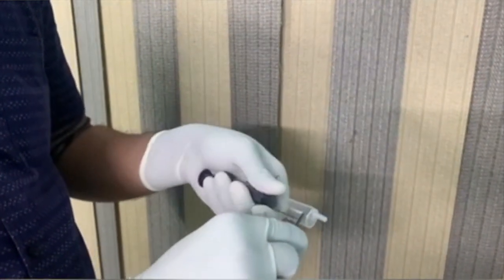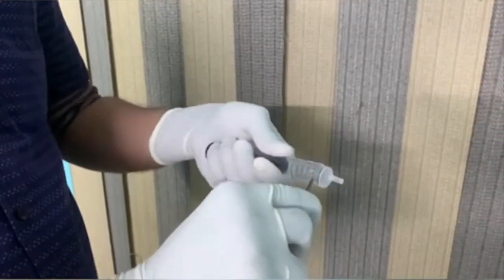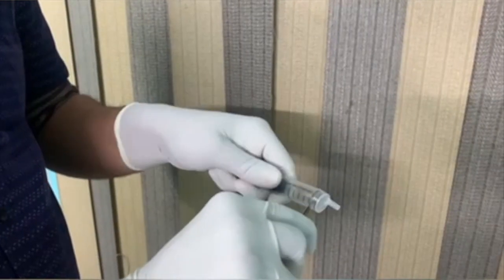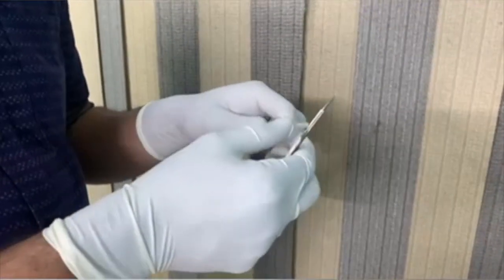After cutting the distal end of the 10 ml syringe, we are reversing the piston to get a small area of suction to do the syringe procedure for CTS.